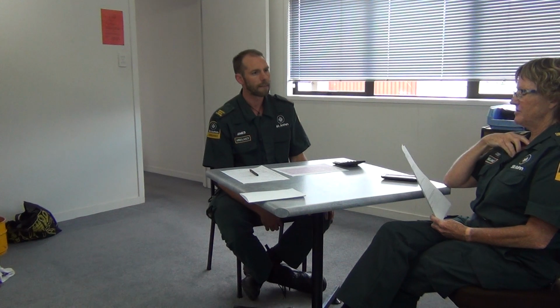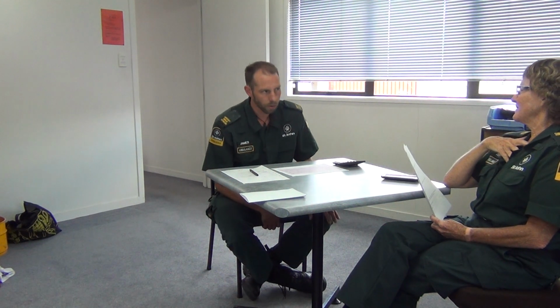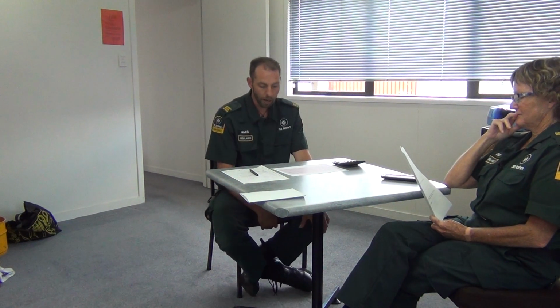How would you determine whether AVRT is WPW or LGL? LGL doesn't have the delta waves. The PR segment, I believe, is still shortened, the same as Wolff-Parkinson-White, but the difference being that LGL does not have the delta wave.